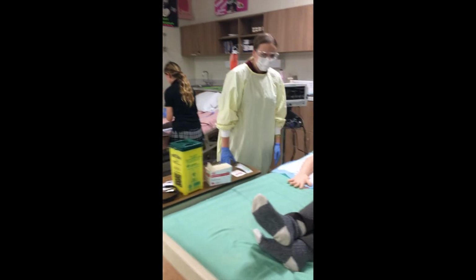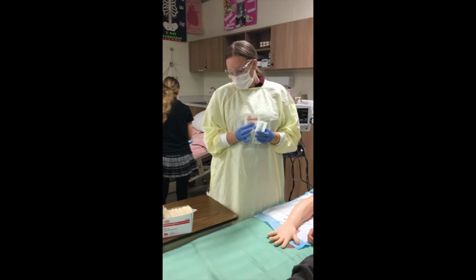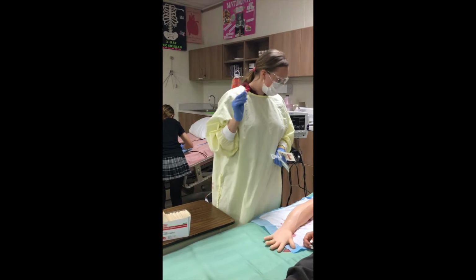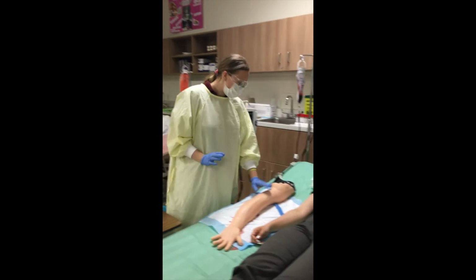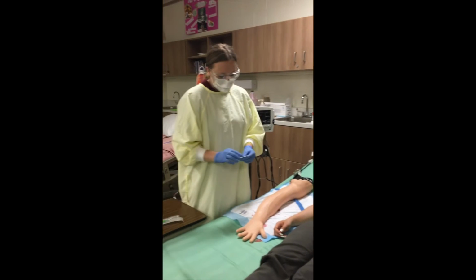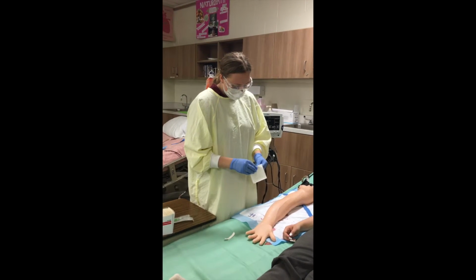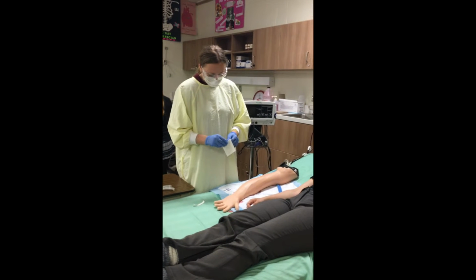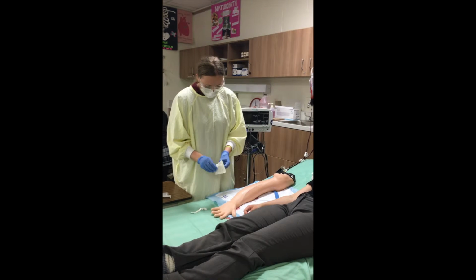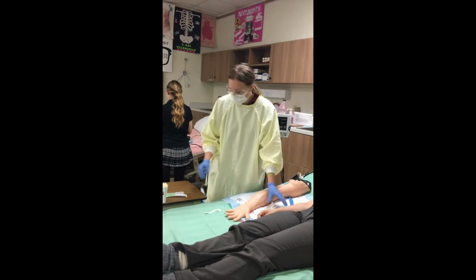Droplet isolation. So first I'm gonna get everything ready. I have my vacutainer, my gauze, an alcohol swab, and I have 2 blood tubes to collect the blood. I also have a tourniquet for the patient's arm. So I'm gonna begin by opening the gauze to get it ready. And then I'm just gonna leave it beside us.